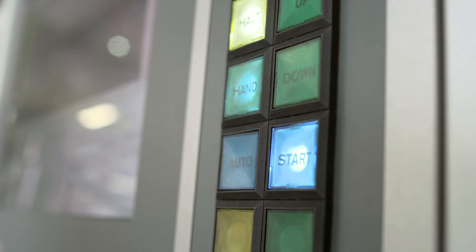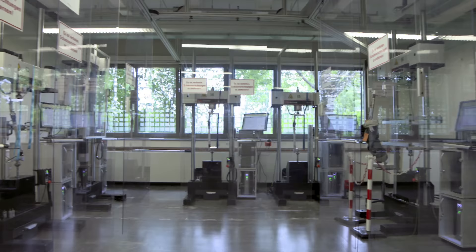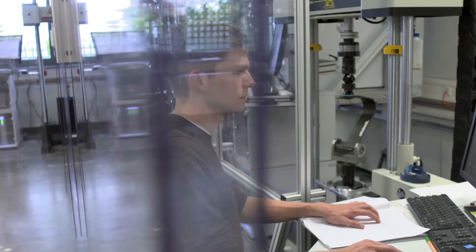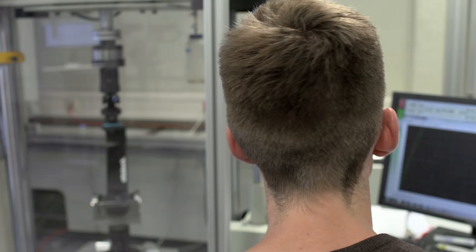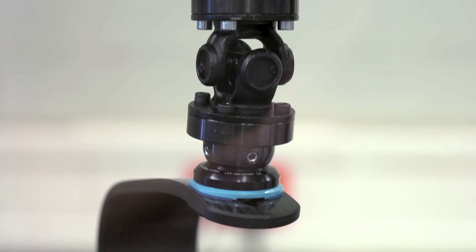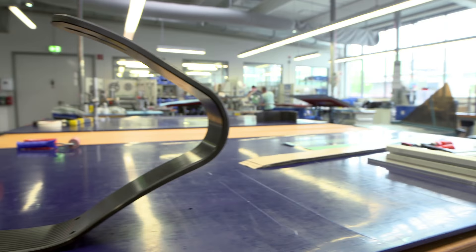Whilst every blade produced faces strict quality control, prototype designs are given even more rigorous testing at the facility's lab to ensure they can endure intensive training and, ultimately, competition. The Ottobock test lab reproduces the forces and angles of use by an athlete like Heinrich Popov over a year of intensive training — 350,000 steps or cycles, with forces up to 6.5 times the body weight of an athlete.